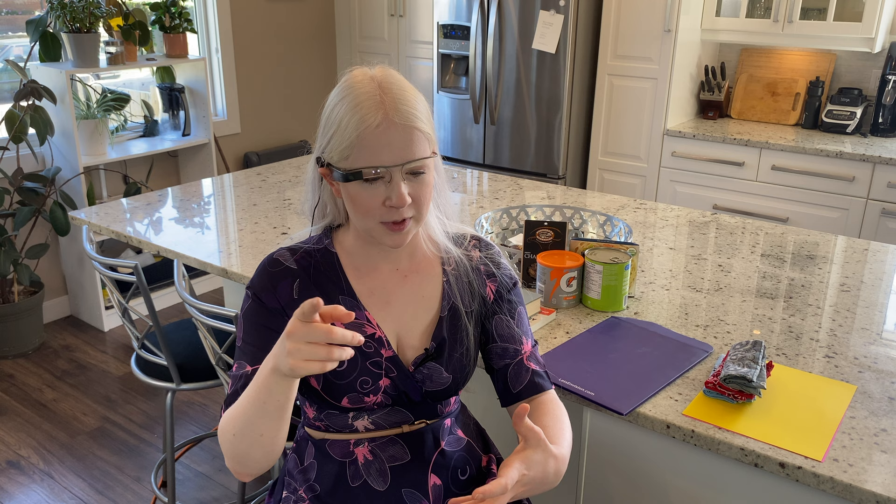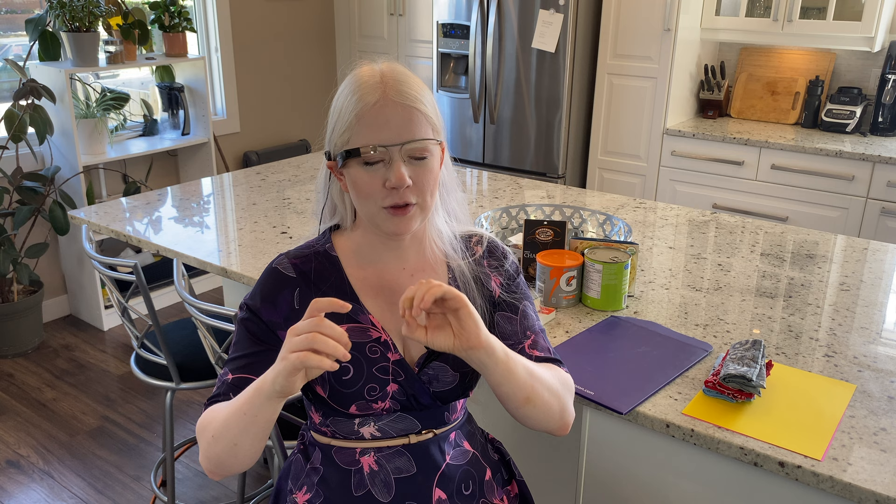From your home menu, you can do a one finger swipe forwards or backwards to move through the different menus to select different features: Read, Call, Identify, Find, Device settings, Feature preferences, Teach faces, Add ally, Instant text, Explore, Describe scene. Many of the features on this device require Wi-Fi. There are only a few that you can do offline, and those would be instant text, detect colors, find objects, find people, and explore — and those are going to be people that you have taught to the device.